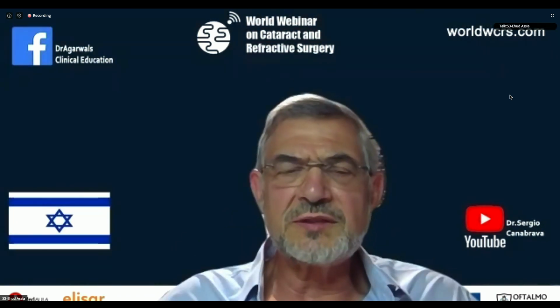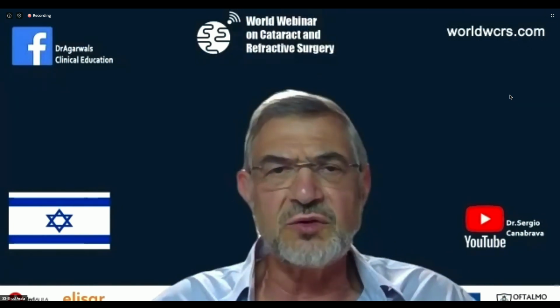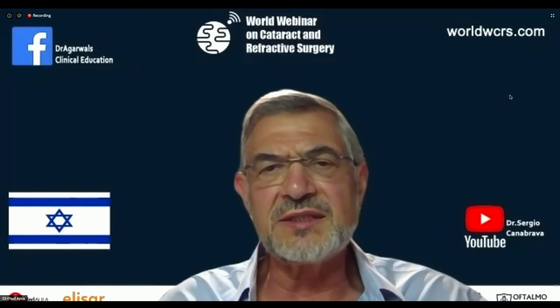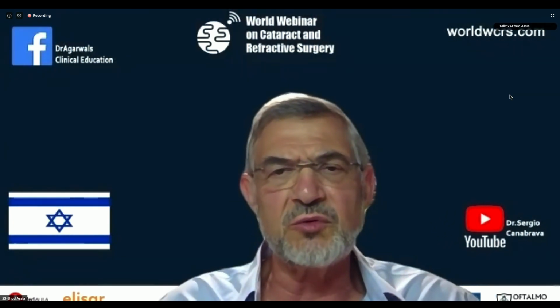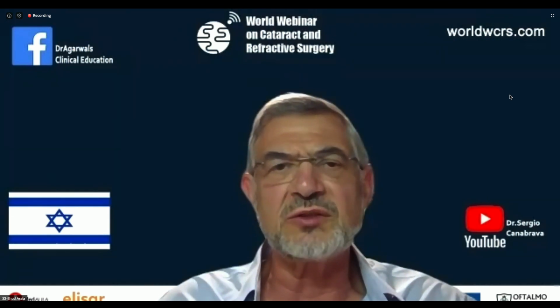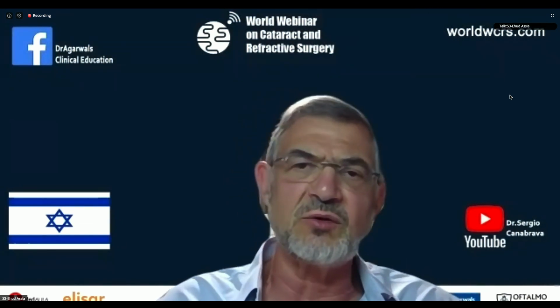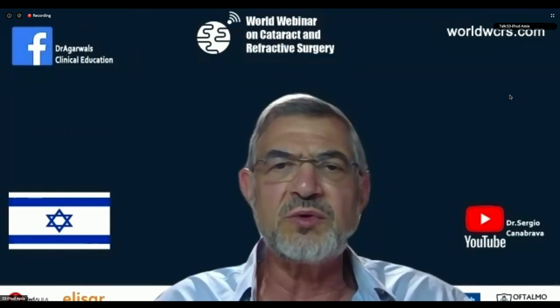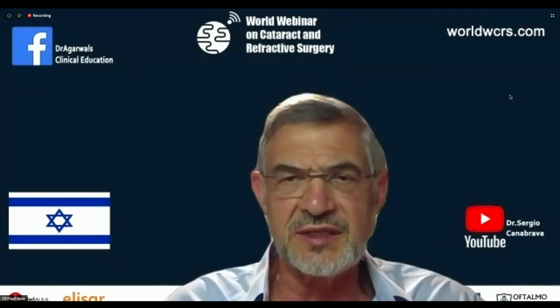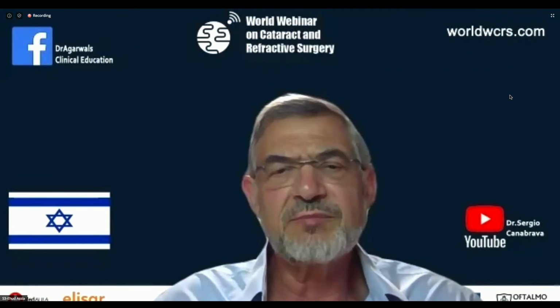Yes, this is correct. My personal preference is to do it at 12 o'clock. I just like to do it instead of bouncing from one side to the other. But I did many cases with a temporal approach. In this case, in order to position the APX, I just ask the patient to look a little bit down, to make it easier to put in one side, and then you ask him to look a little bit up, or move it with the forceps. But it's not a concern. It does need slightly different manipulations, but it goes in easily just as well.